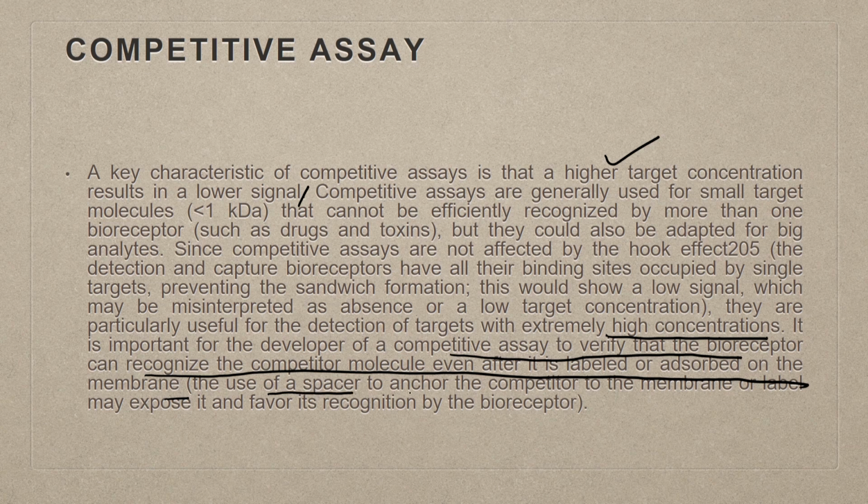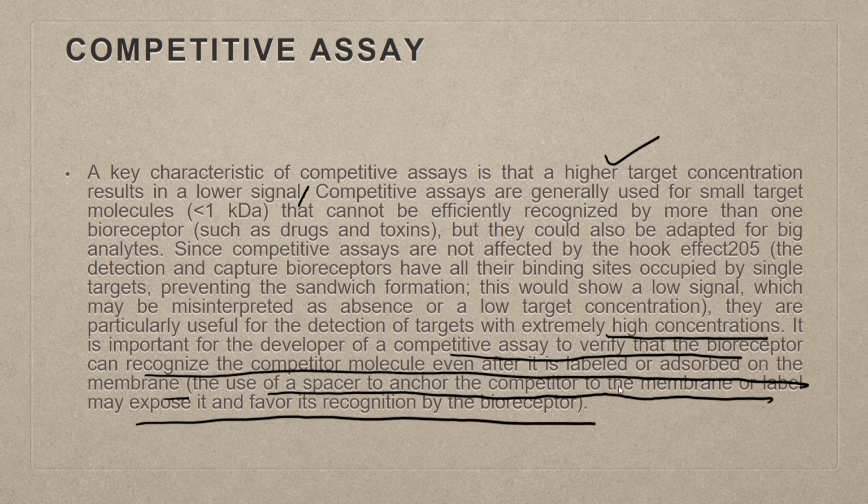The use of a spacer to anchor the competitor to the membrane or label may expose it and favor its recognition by the bioreceptors. So this is the basic of the competitive assay.